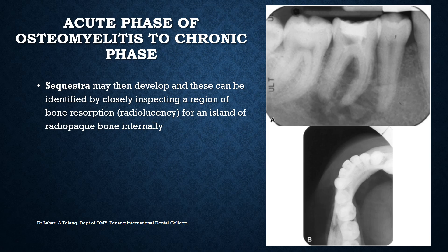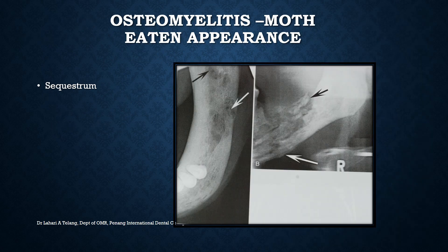You can also see the enlargement of bone at the periphery on this occlusal view. The typical appearance of osteomyelitis is called a moth-eaten appearance. The black and white arrow marks point towards involucrum and sequestra, giving it the classic moth-eaten appearance.